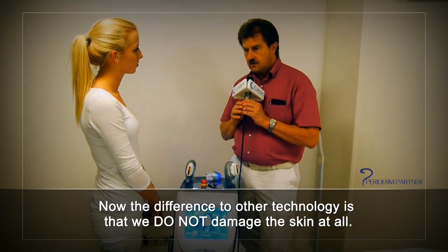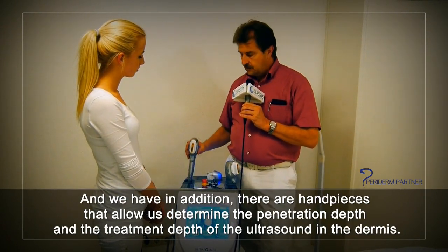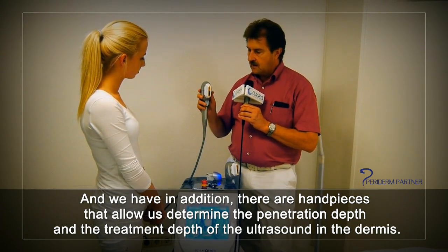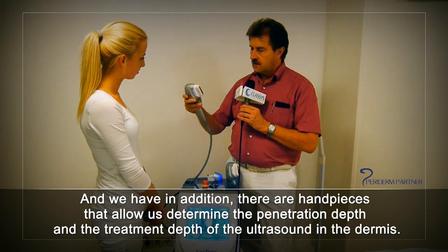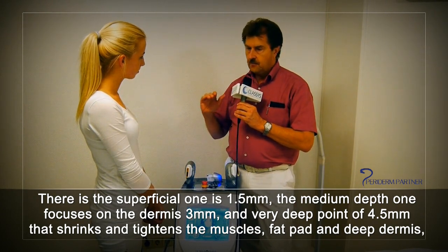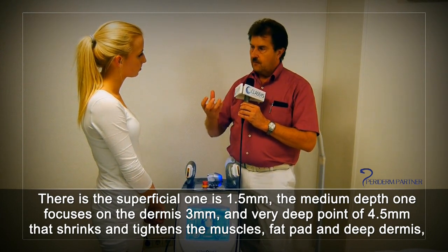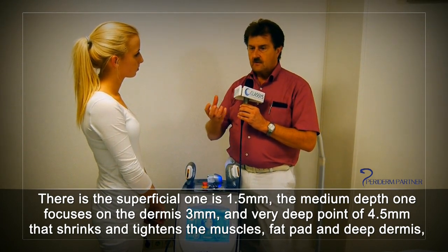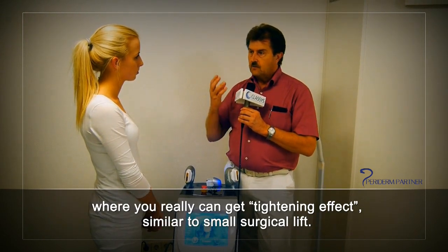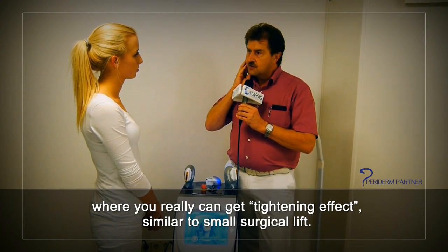The difference to other technologies is we do not damage the skin at all. We have various handpieces that allow us to determine the penetration depth and treatment depth in the dermis: the superficial one at 1.5 millimeters, the medium depth one focusing on the dermis at 3 millimeters, and the very deep one at 4.5 millimeters that shrinks and tightens the muscle, the fat pad, and the deep dermis — where you can really get a tightening effect similar to a small surgical lift.